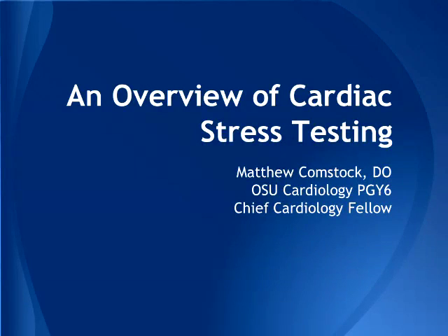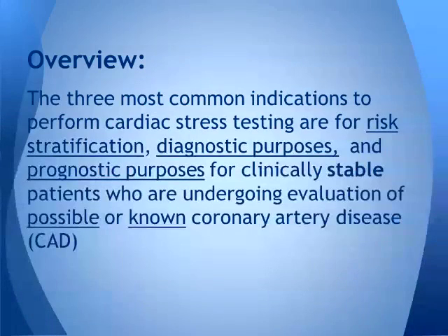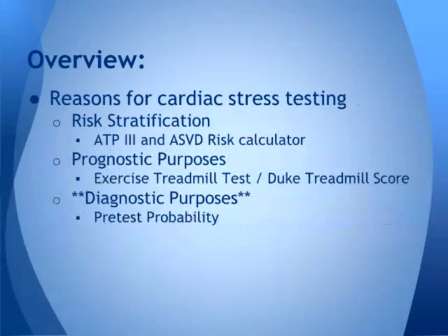All right. So stress testing is something we commonly do, and there's a few things we got to review about them. Common indications for stress testing are risk stratification in patients who do not have known coronary disease, diagnostic purposes when you're trying to uncover coronary disease in a patient presenting with symptoms suggestive of angina, or prognostic purposes for patients who have known coronary artery disease or previous MI. The key to stress testing is it's done in stable patients.